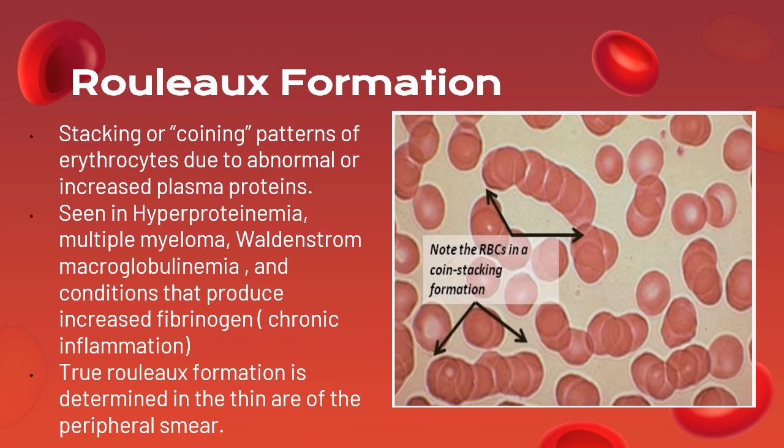Why? Because on the thick part, the RBCs there naturally show rouleaux formation, since you are in the thick part. Once you go to the thin part and you still see rouleaux, that is the true rouleaux formation.